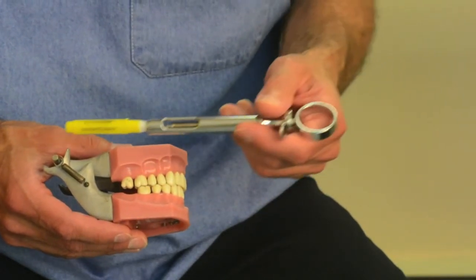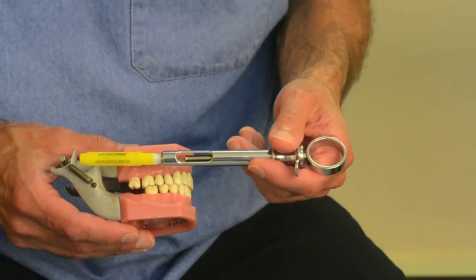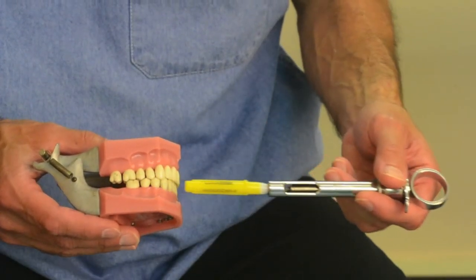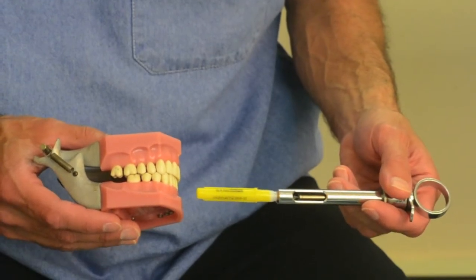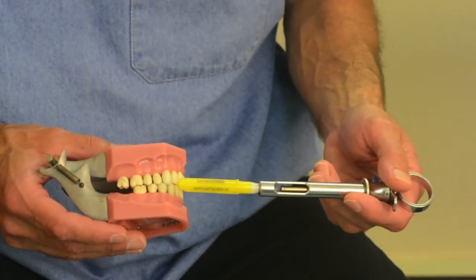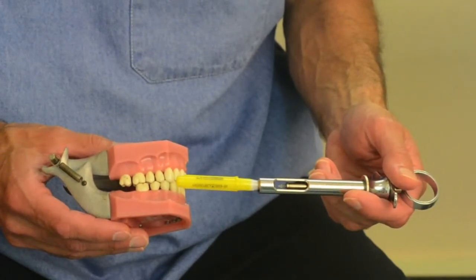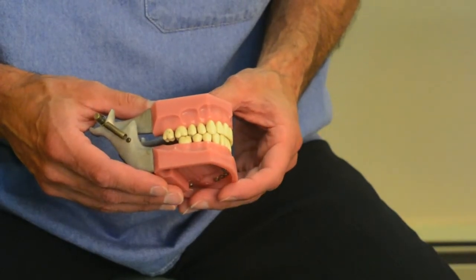By combining the closed mouth Akinosi mandibular block injection with infiltration anesthesia to the fracture lines themselves, you can usually obtain an adequate amount of local anesthesia to allow you to manipulate mandibular fractures and fixate them.